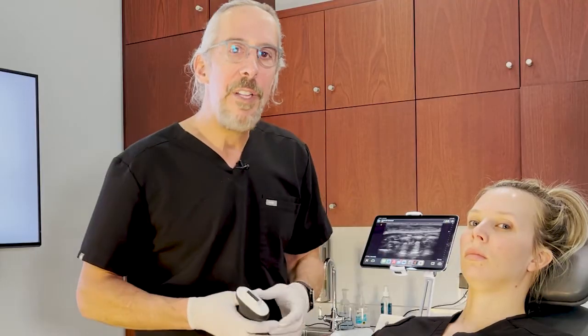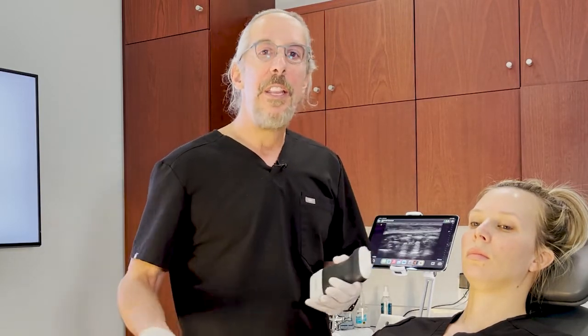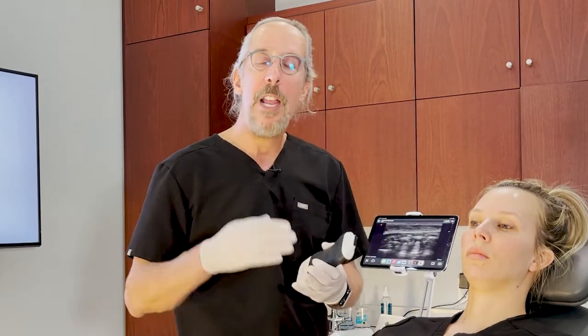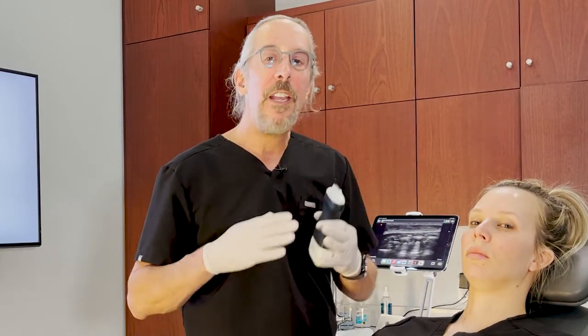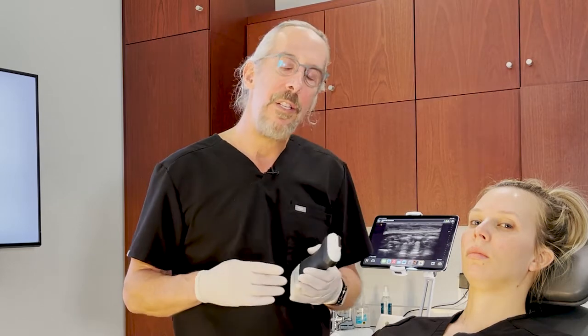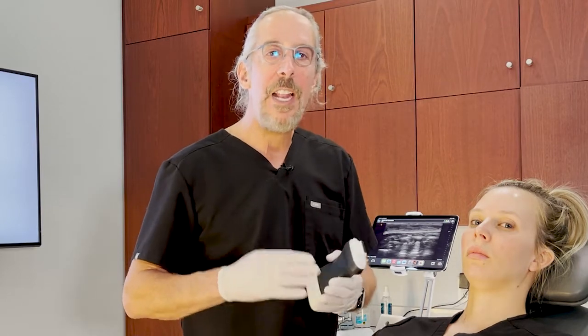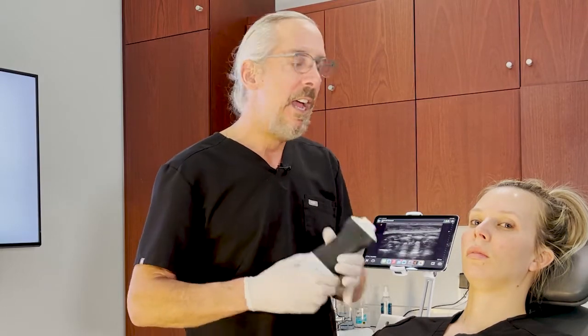As you've just seen, I've identified the location as well as the depth of several vessels in this patient's face. The next step is for me to inject, and I'll inject either with needles or cannulas, but I'll keep in mind at what depth I want to be to create a very safe environment for the patient. It gives the patient a little assurance that I've gone the extra step and that she's going to get a safer injection. But it also gives the patients a little assurance that if, God forbid, something were to go wrong, I could identify it and take care of it very quickly and easily using ultrasound. I don't have to panic. I've got all the tools right here.